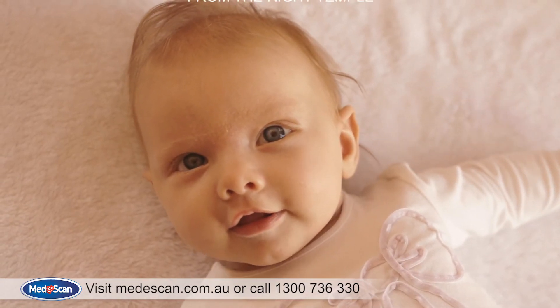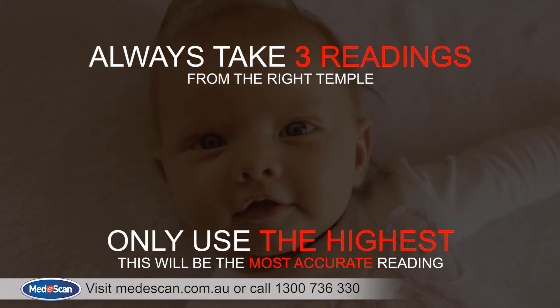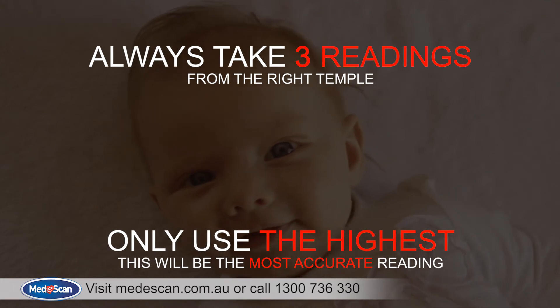For infants, always take three readings from the right temple. If you get different readings, don't worry, that's normal. Just use the highest reading.